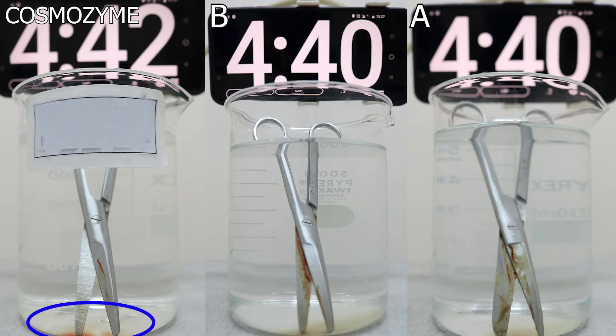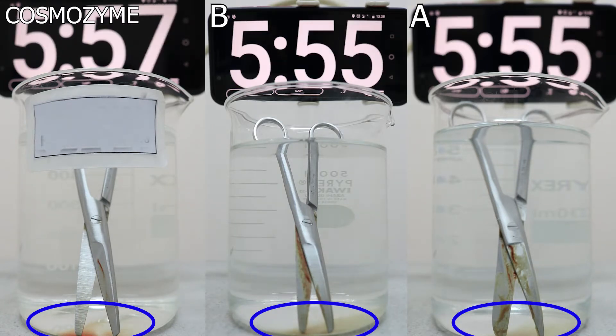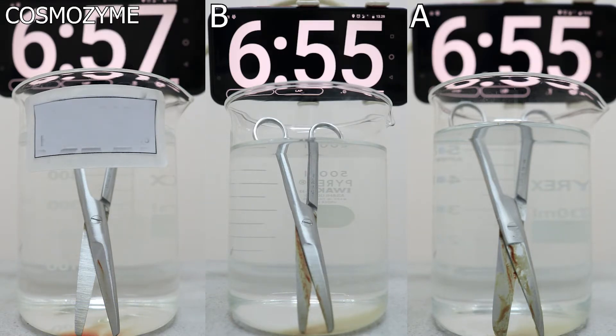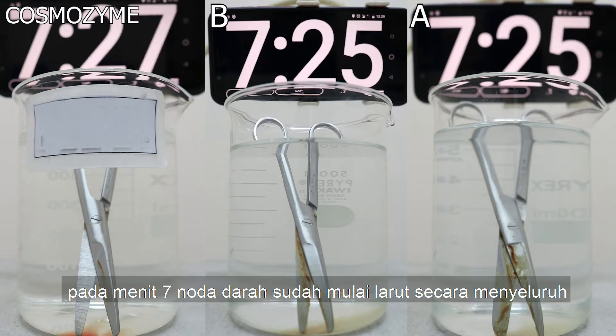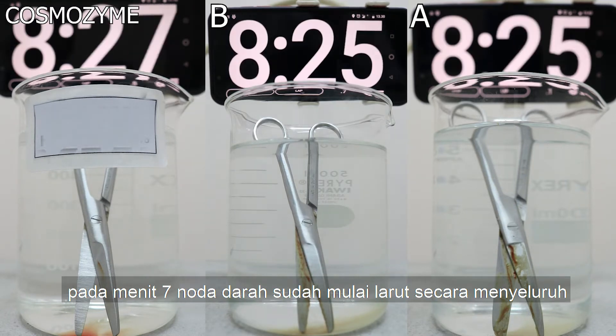The blood stains start to dissolve. We can see at the bottom of the beaker more blood is dissolving. In seven minutes, more blood starts to dissolve evenly. We can see the difference in the blood on the surgical instrument.